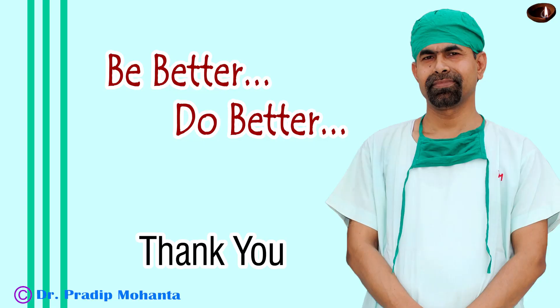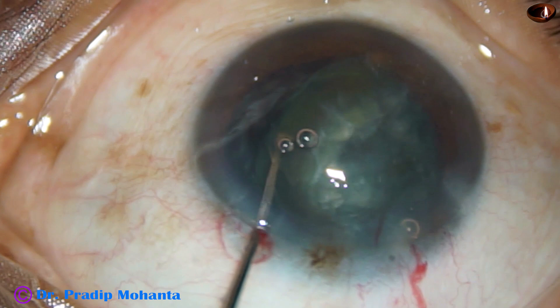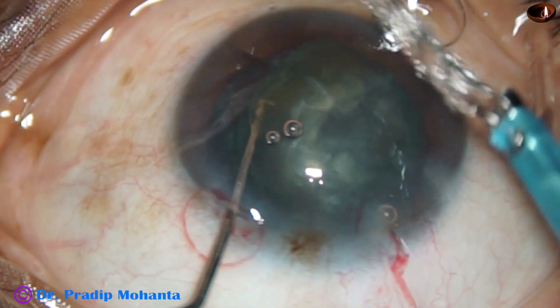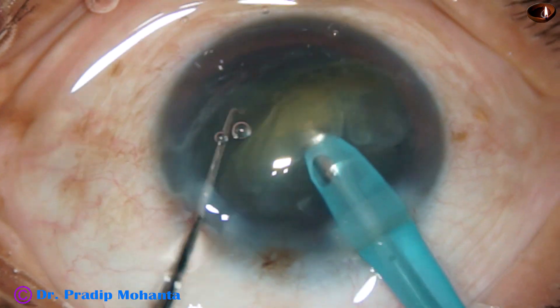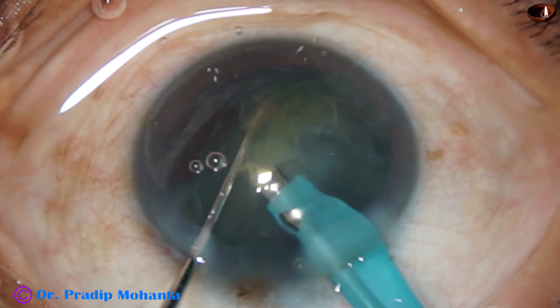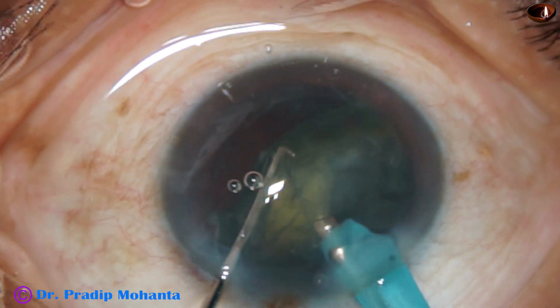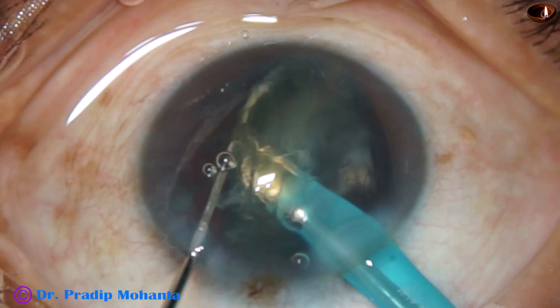Thank you very much for your attention. Even in a very routine surgery, we can have a lot of struggles. In soft cataracts, if we can tilt the nucleus and support it with a chopper from behind — supporting the posterior surface of the cataractous lens mass — and use the phaco tip to start eating off the lens mass at the iris plane, any soft cataract can be conquered. Thank you very much.